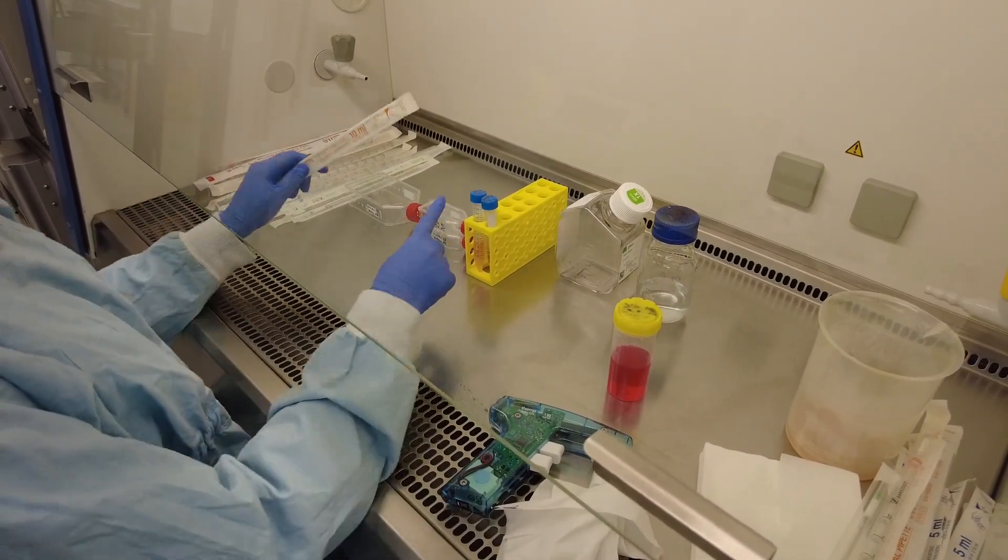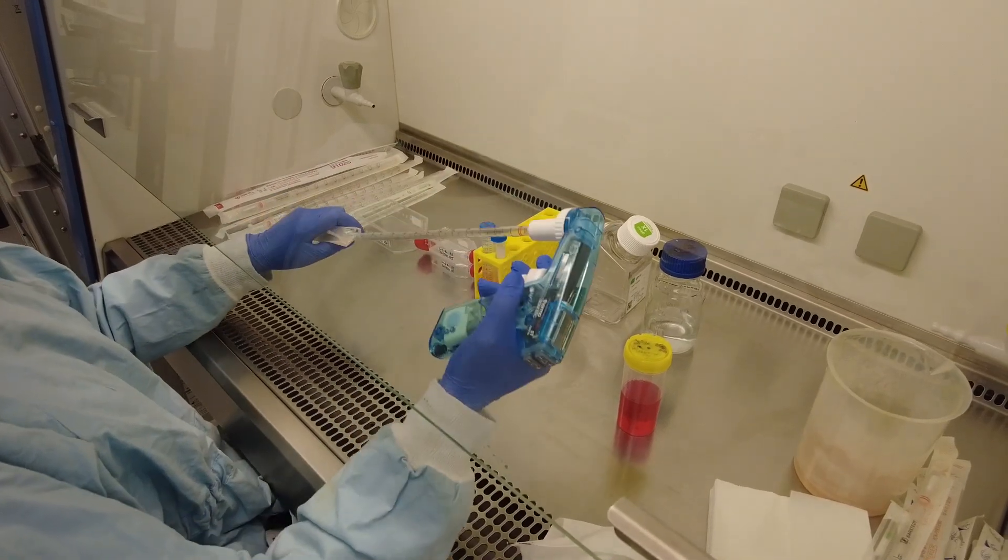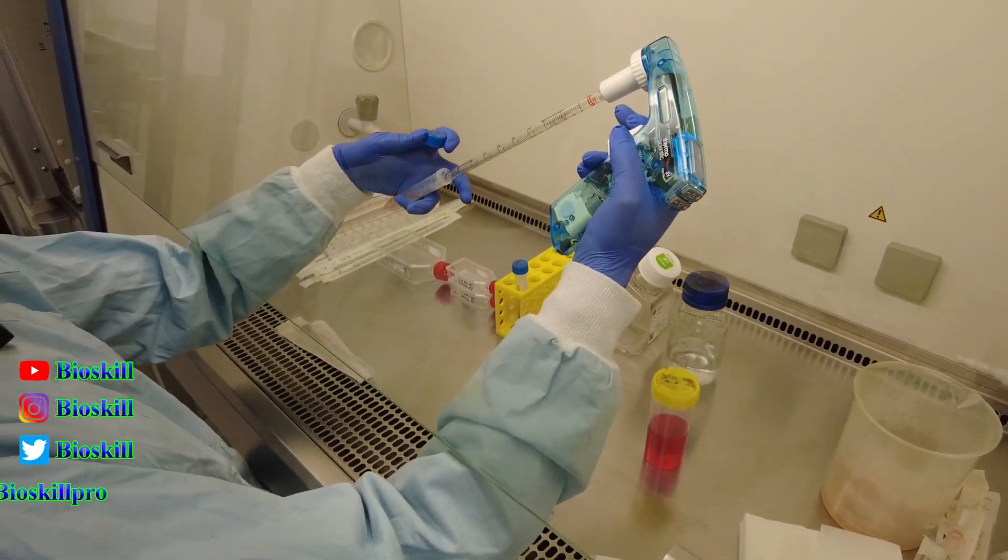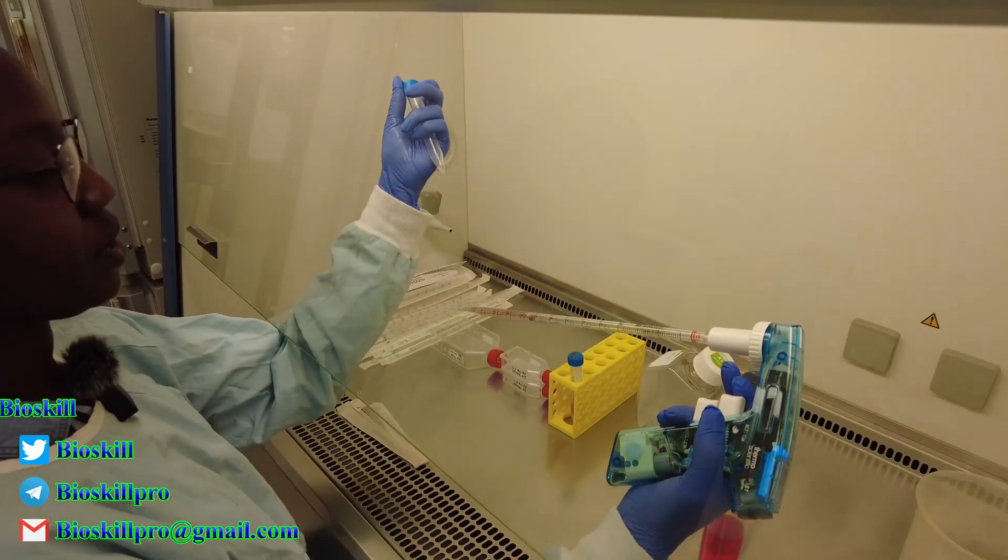So now we're going to remove the media from each flask. We'll do them one at a time. So removing the media from tube number one. Leave a little bit of media at the bottom there.